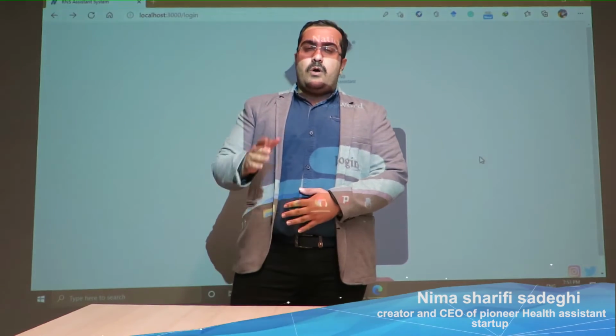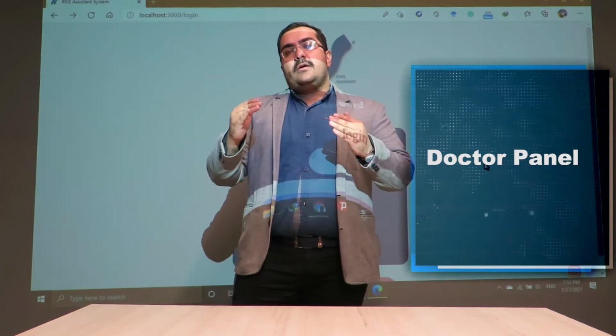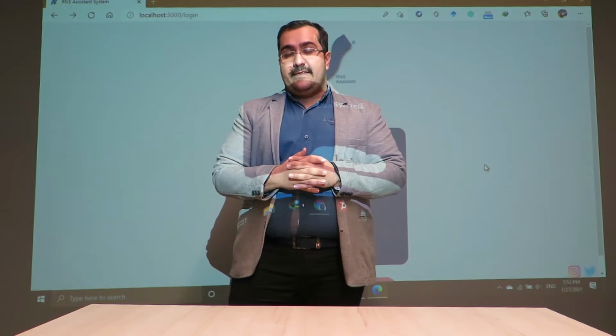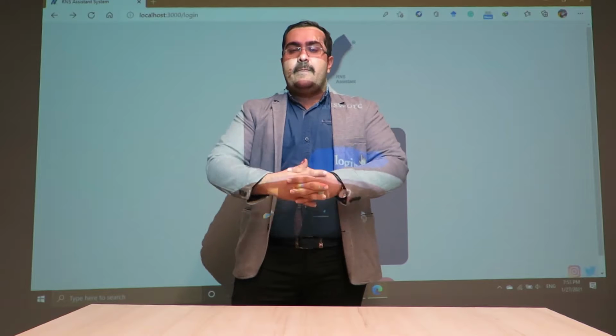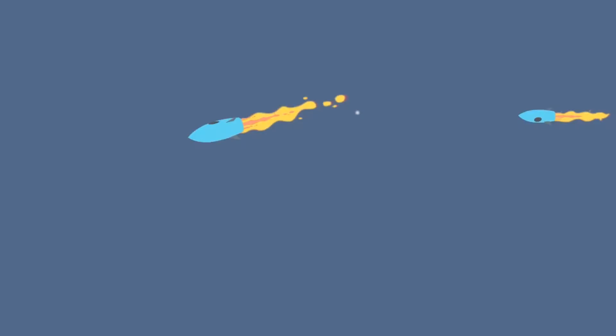In this series of videos, I want to talk about our doctor panel in the neurological disease system-based neurological software. Join me, and I will talk about our specifications and services in this software. I want to dig into our application and talk about its features and the different types of problems that this panel can solve. Join me.